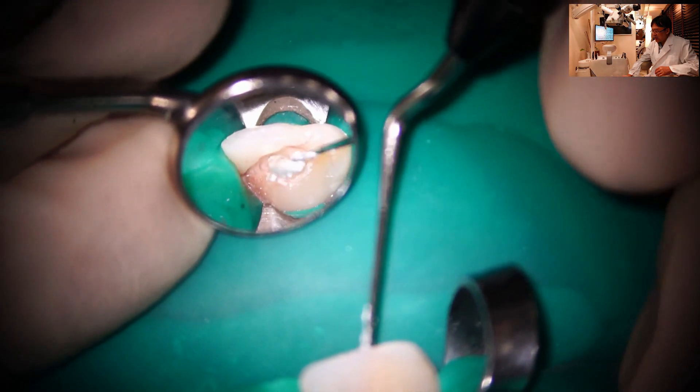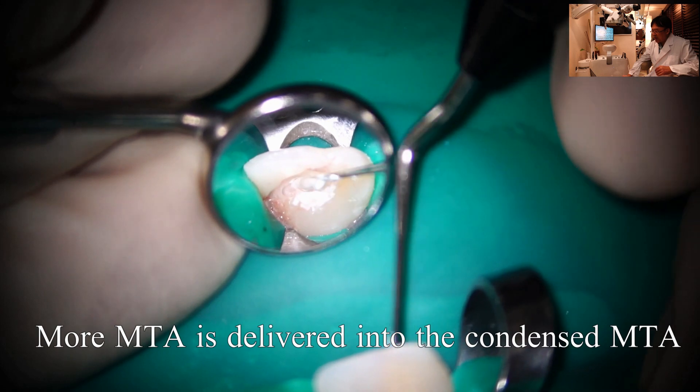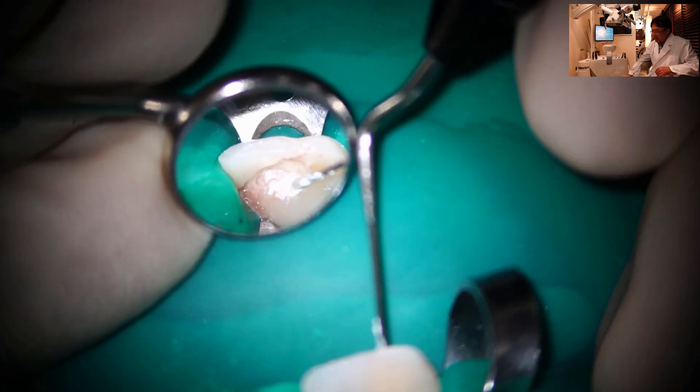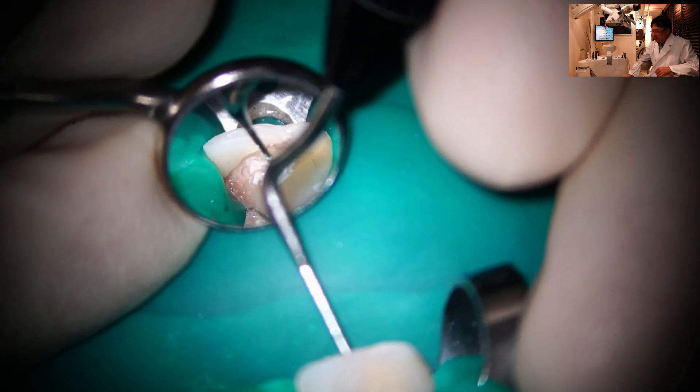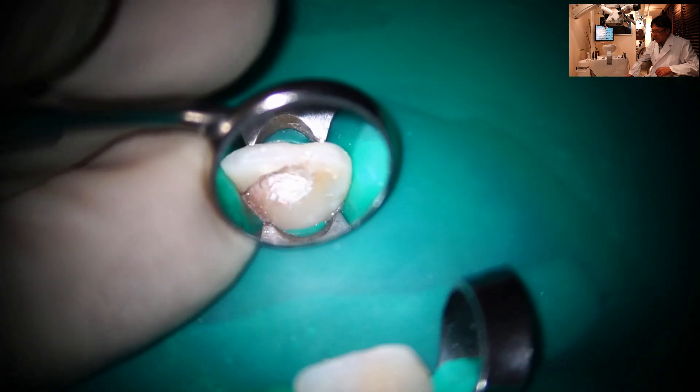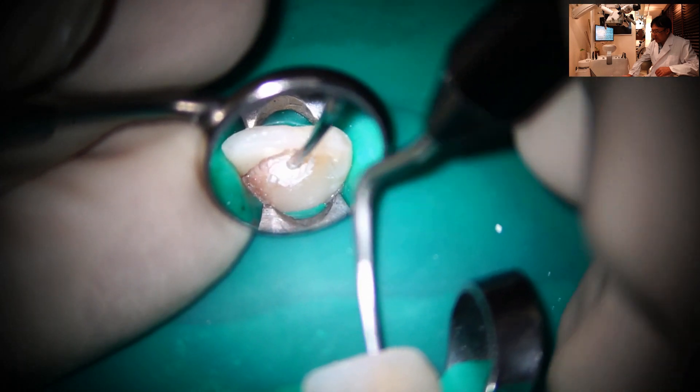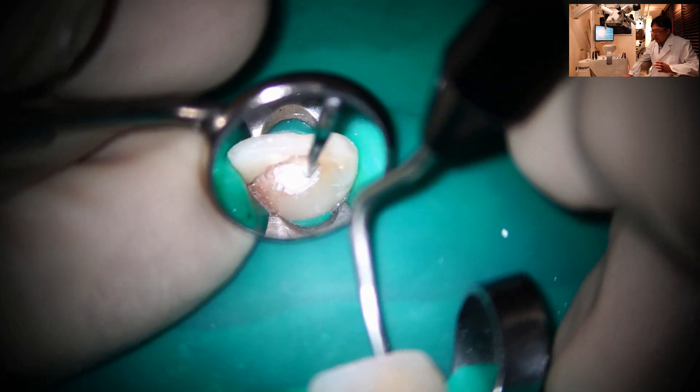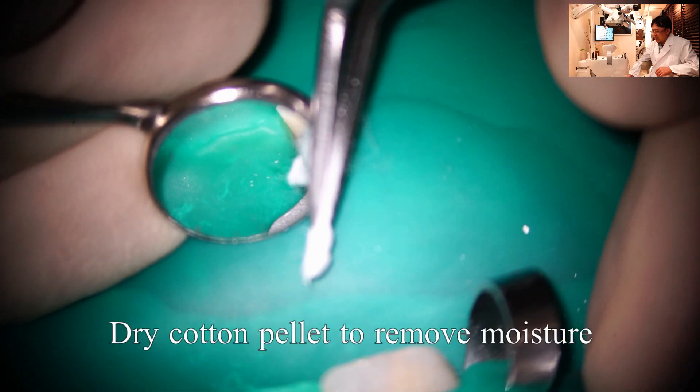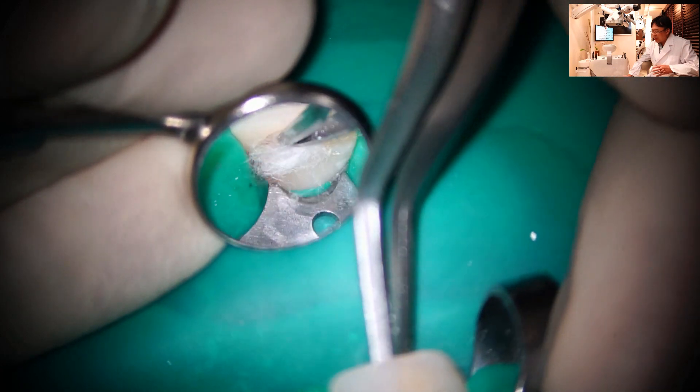Then I want to add more MTA. And you need to have at least 1mm thickness of MTA over the blood clot. Again, here comes the dry cotton pellet to remove moisture and condense MTA.